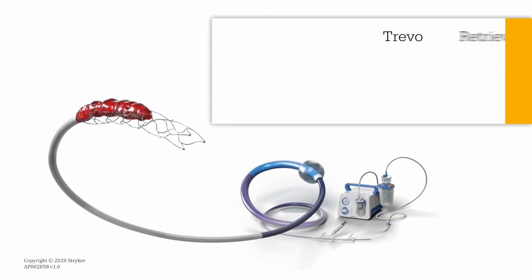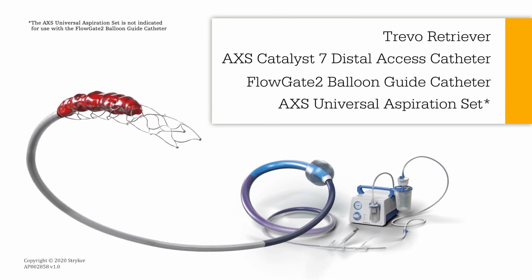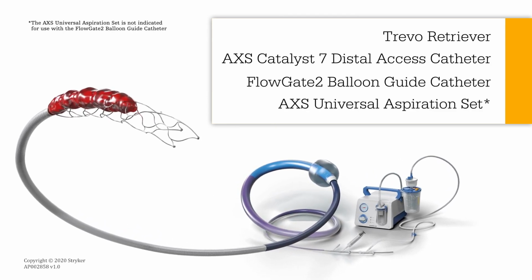For me, over the years, it came down to having a balloon guide, an intermediate catheter at the face of the clot, and a stent retriever deployed and interacting with the clot. When all these forces are interacting together, you have aspiration locally and proximally with flow reversal, and the stent retriever protects the clot from embolization while grabbing the clot together with the aspiration.